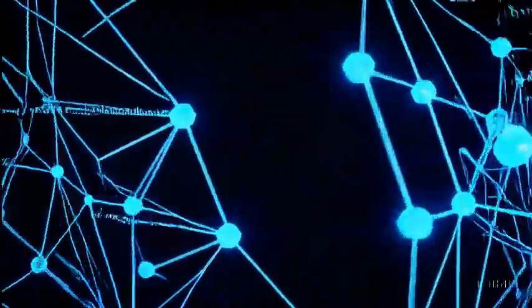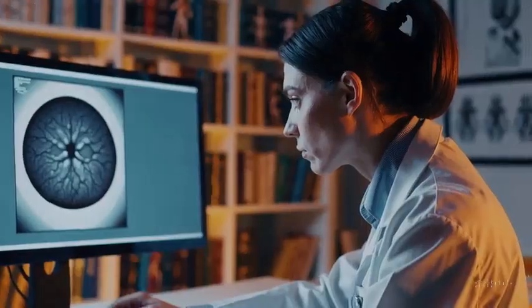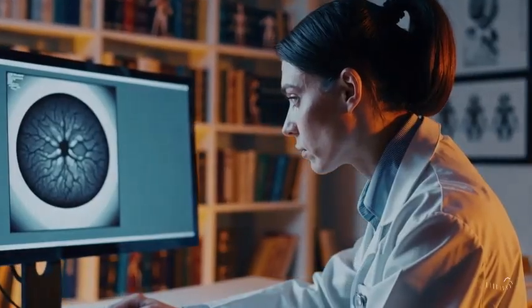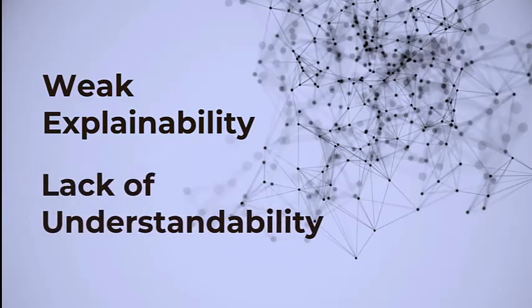Even though there exist many machine learning models to diagnose diabetic retinopathy, they are not used by the medical personnel due to weak explainability and lack of understandability.